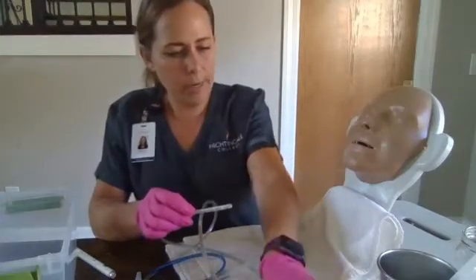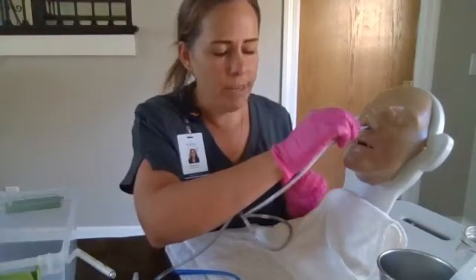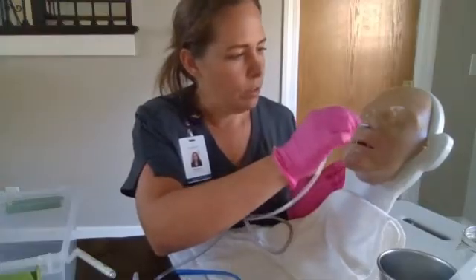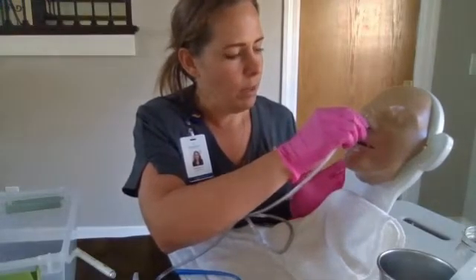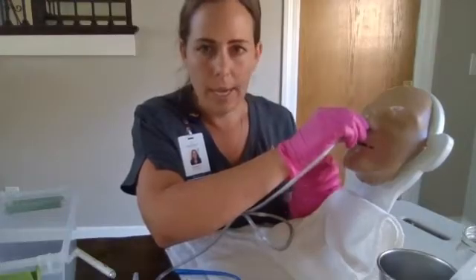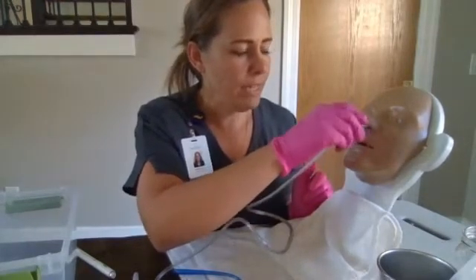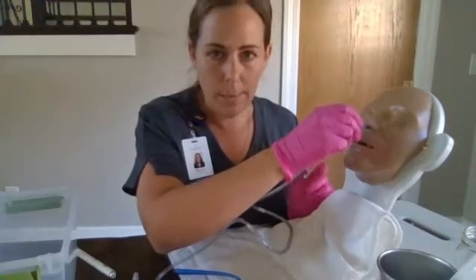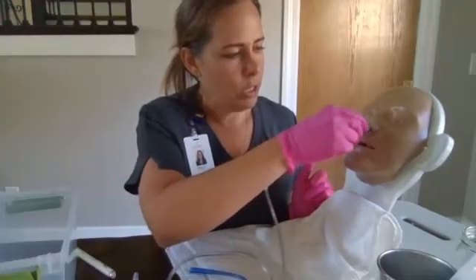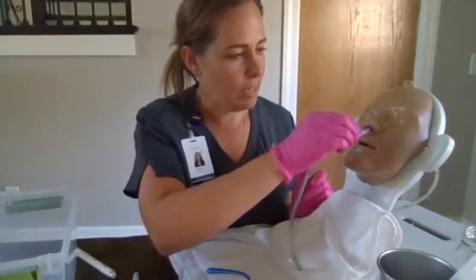We're going to lubricate our tubing. We're going to have him look up and insert. If we encounter any resistance on the initial insertion, we're going to withdraw it, relubricate it, and try the other nare. We're going to follow the nasal passage back. When it reaches the oropharynx, we're going to instruct him to bring his chin to his chest and take some sips of water. Each time he takes a sip of water, we're going to advance it two to four inches. If he has any gagging, we can stop, let him take a couple sips until the gagging has subsided, and then we will continue. Two to four inches with each swallow until we reach that 50-centimeter mark.